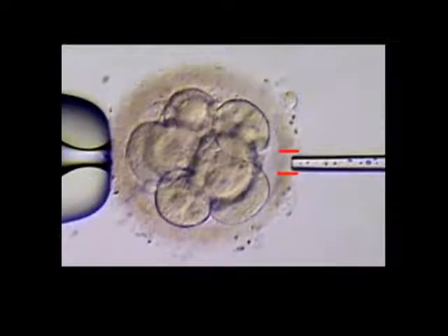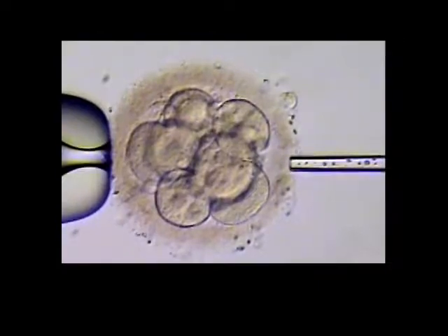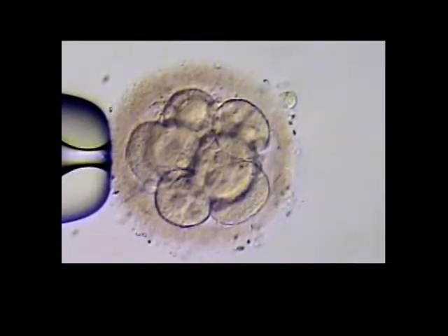Now with the video paused, we can see the hole in the shell between the red lines. Assisted hatching has been completed and we put the embryo back in the incubator until it is time for embryo transfer.